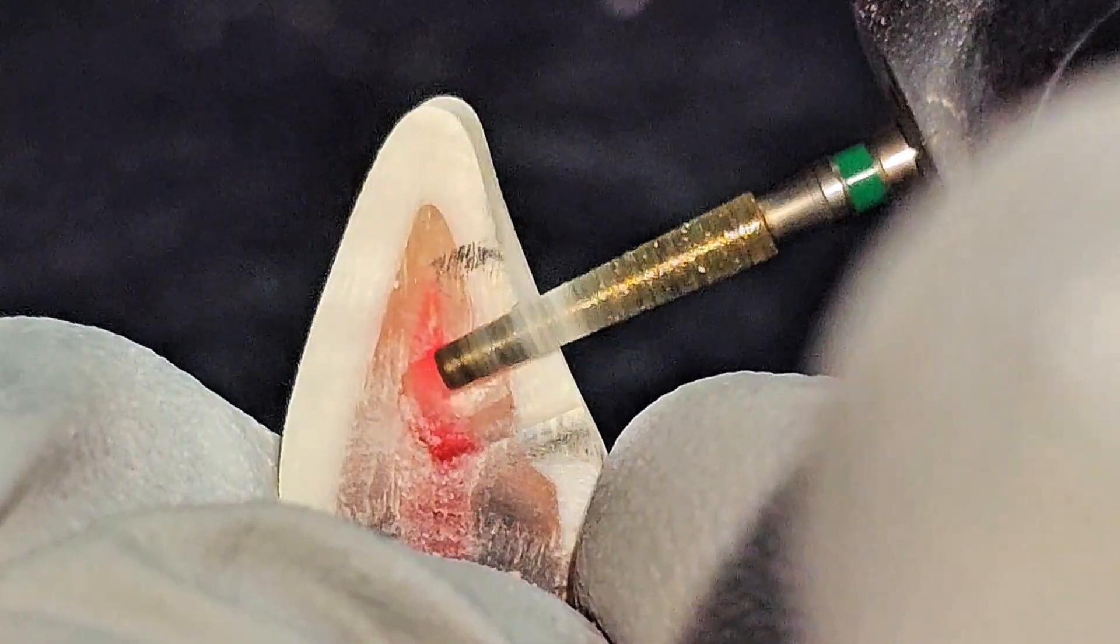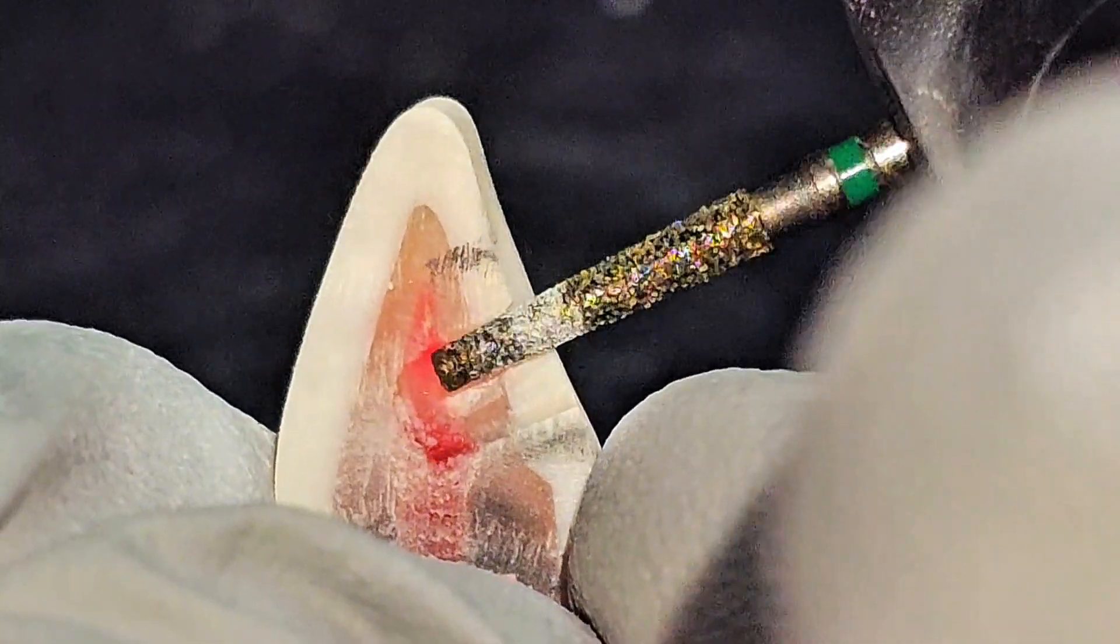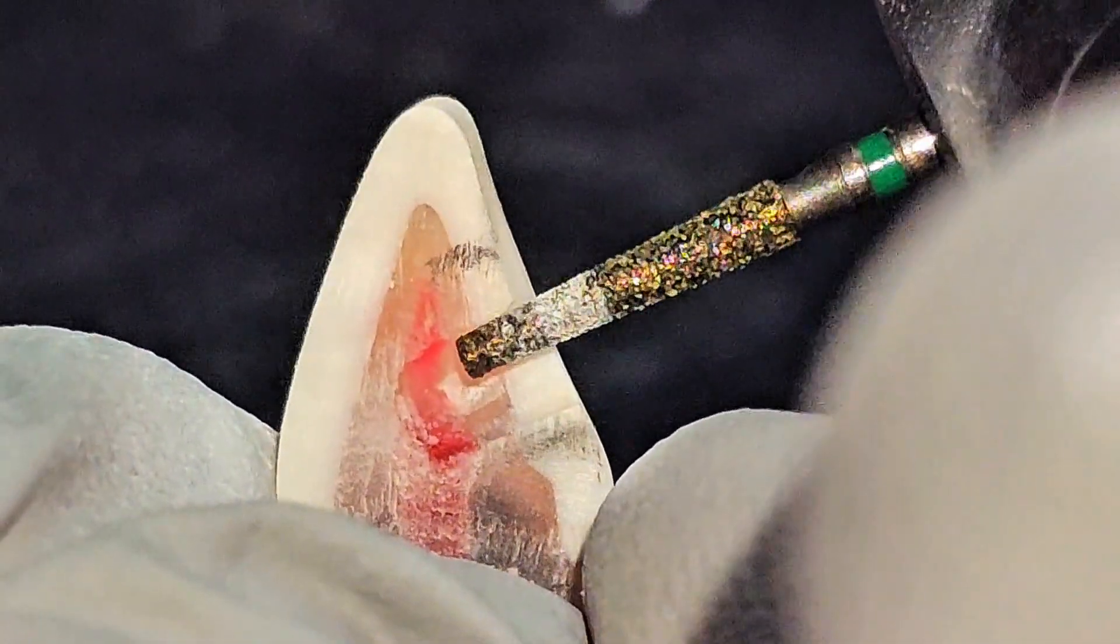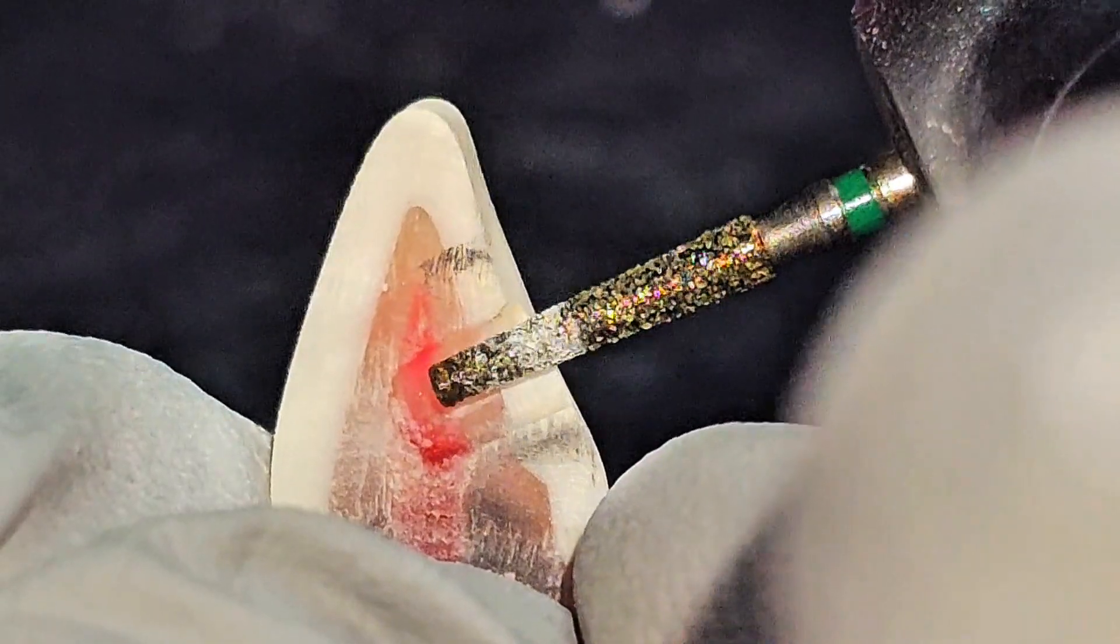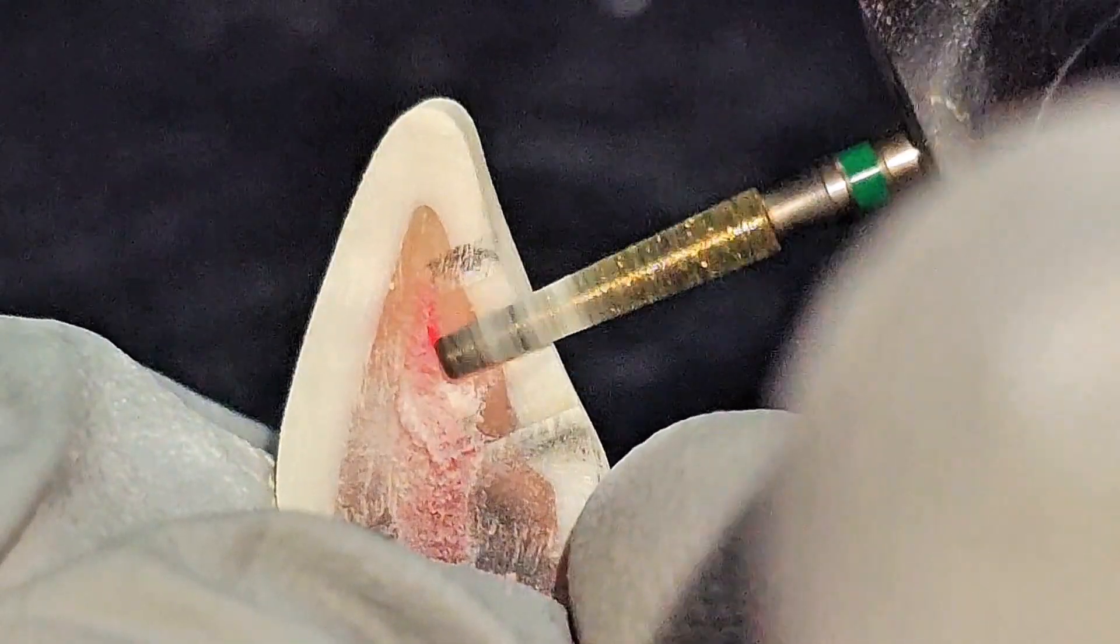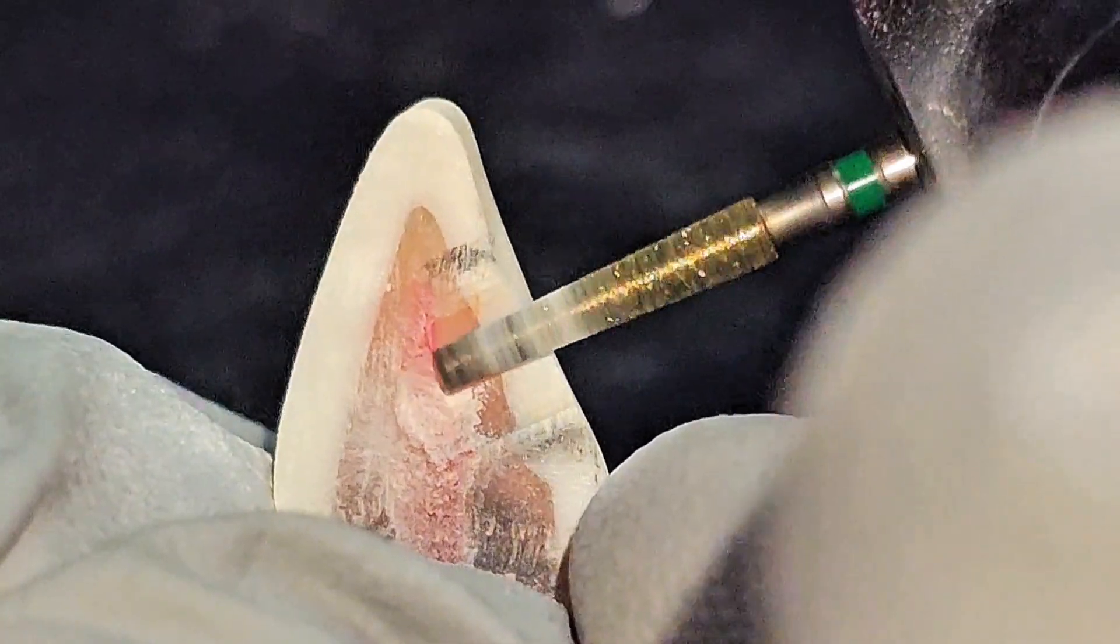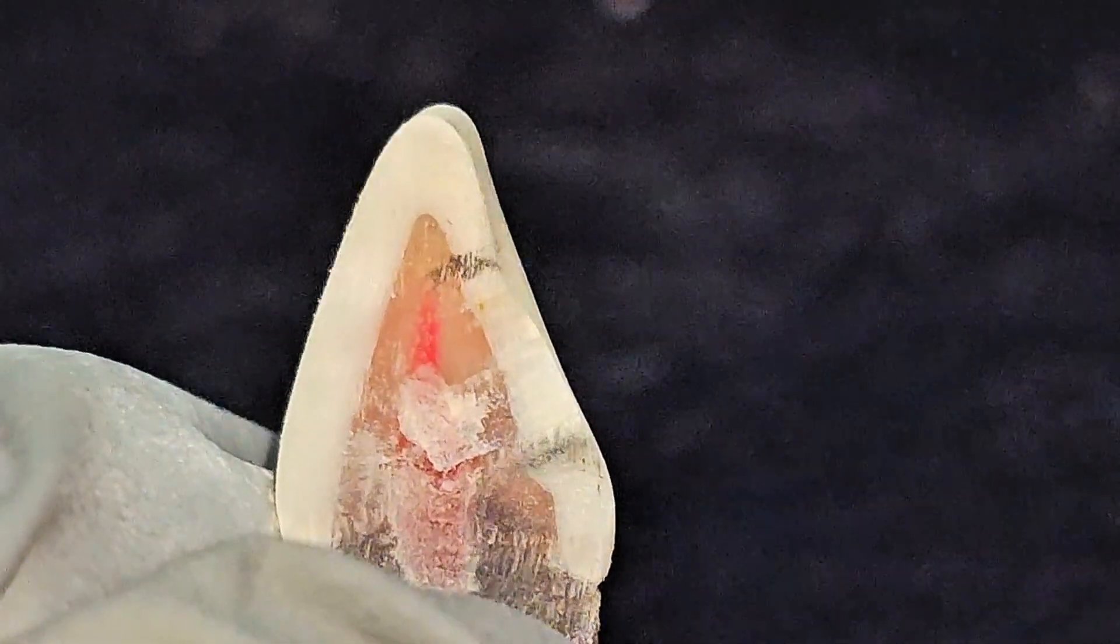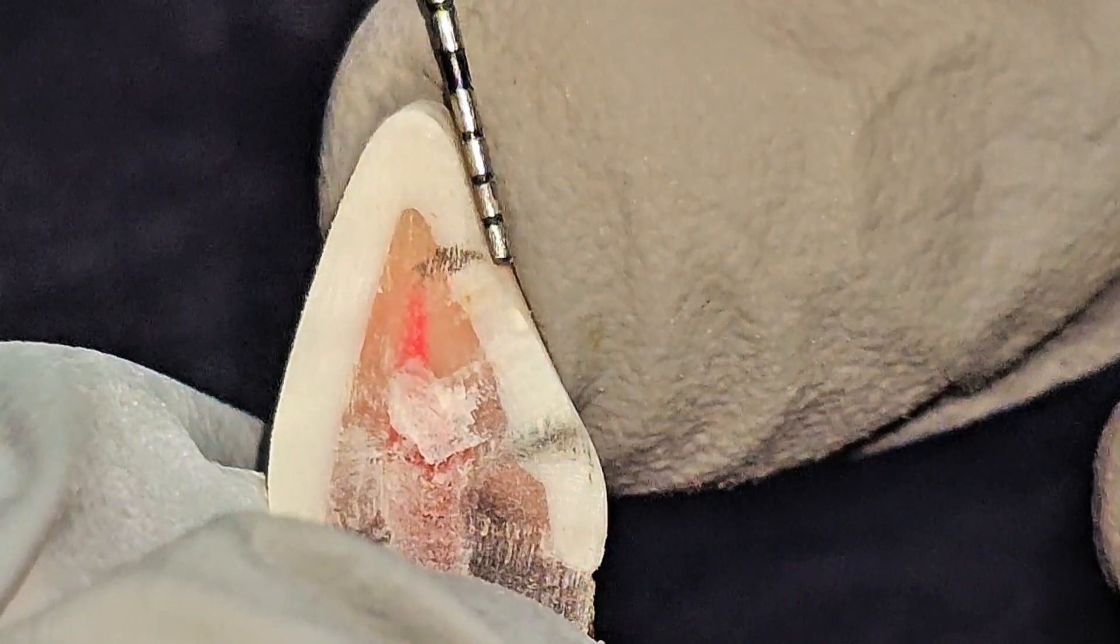So I'm holding the bur perpendicular right to the lingual surface. And at this point I need to pause a little bit and then measure whether I have enough room. So I have three millimeters, so I can still go further up.